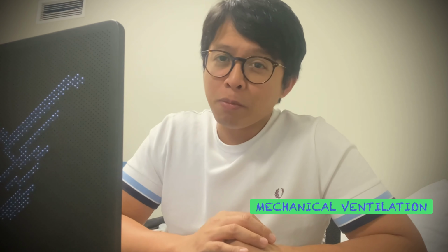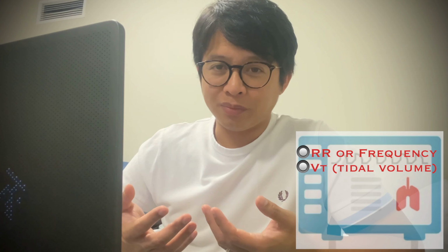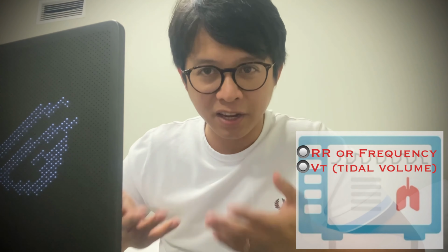Okay? Now, what do you have in your mind when you hear mechanical ventilation? It's a machine that breathes for an ill patient or aids the patient to breathe, right? Because normally when we breathe, we inhale and exhale. Count that cycle in a minute and that is your RR, or the respiratory rate, right? Each time we breathe, we're taking a tidal volume. That's the amount of gas we're taking inside our lungs and exhaling.